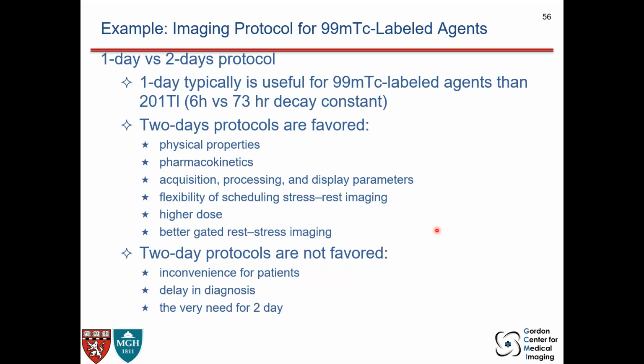So again, it depends on the isotope, and the 2-day protocol are typically favored because of the pharmacokinetics and acquisition, processing, and the display parameters, flexibility of scheduling for stress and rest. Higher dose can be tolerated, and better gated rest stress imaging. These are all components that come with 2-day protocol versus 1-day protocol.